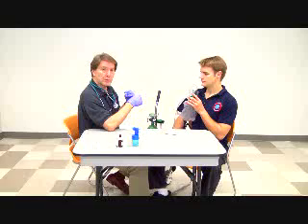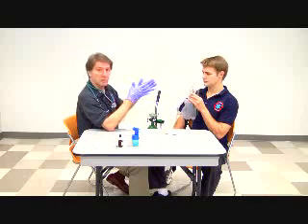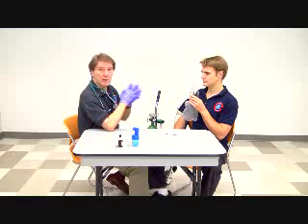Okay, we're now going to transport the patient to the most appropriate hospital. The entire time we're transporting, we're going to monitor the patient, including the vital signs, contact medical control as necessary, and request any orders if that is needed, and lastly, document the procedure.